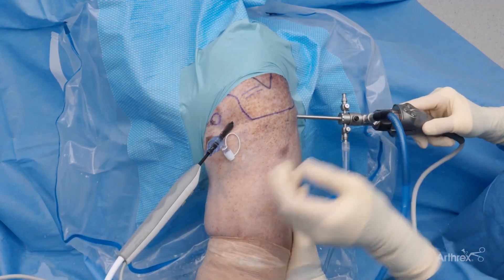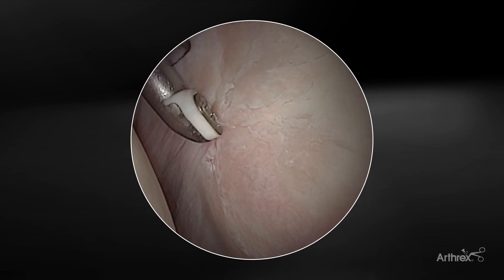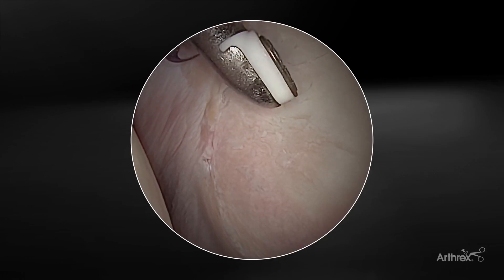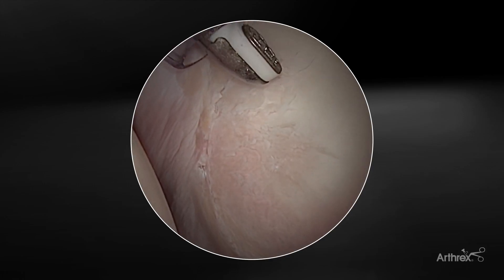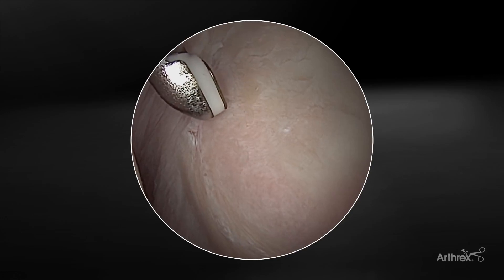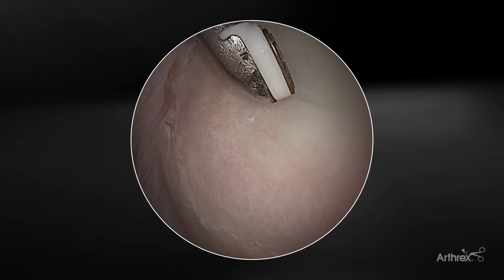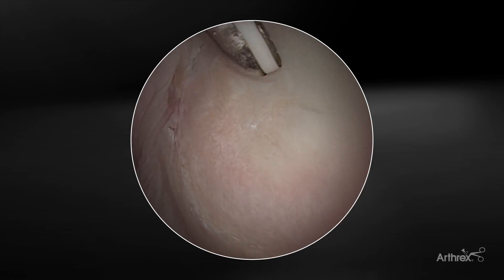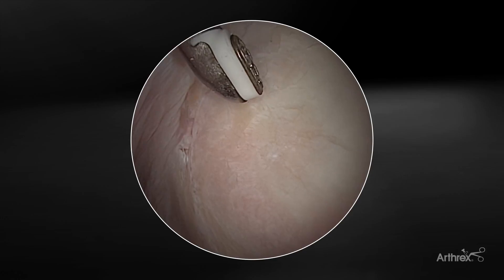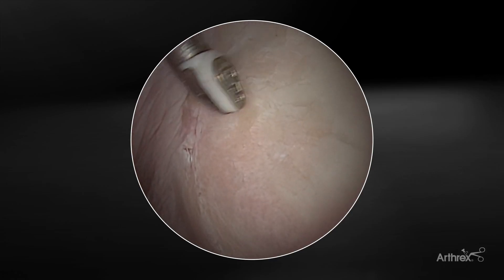Moving on to the glenoid — some degenerative grade 2-3 chondral changes. This device works well when treating chondral lesions for a chondroplasty, due to that well-contained plasma field. As the plasma contacts that diseased cartilage, you can see some macroscopic changes in the cartilage, allowing for debridement and stabilization of the lesion. The geometry of this device is great — you get a really well-defined field of plasma on the tip. That tip can hover over the cartilage lesion, creating changes in the tissue, debriding and removing the diseased tissue while preserving the healthier tissue underneath. It really allows for precision of use because of that well-contained plasma field.